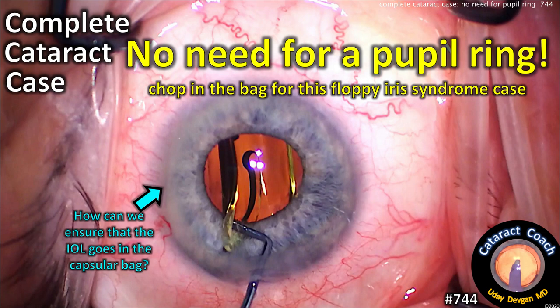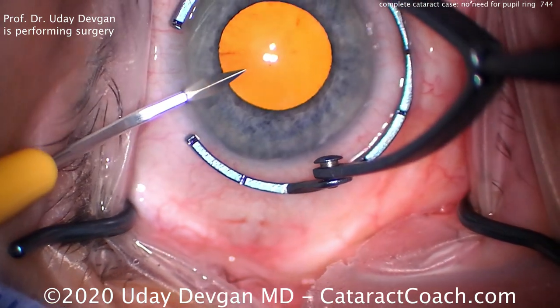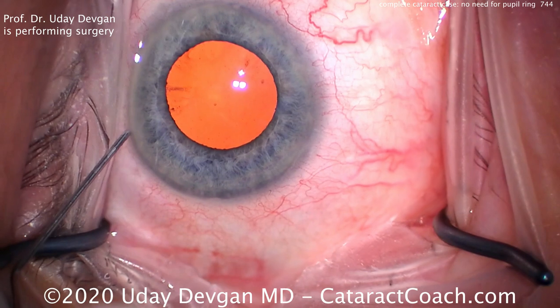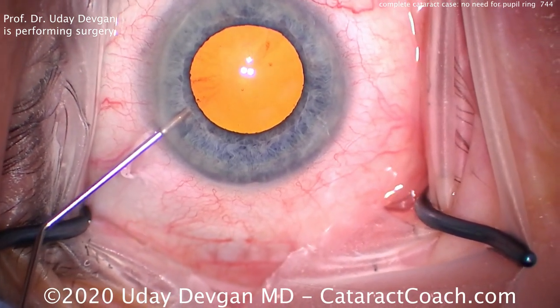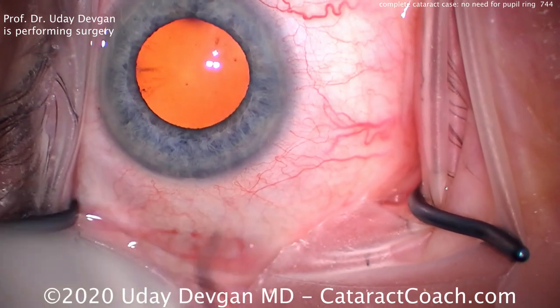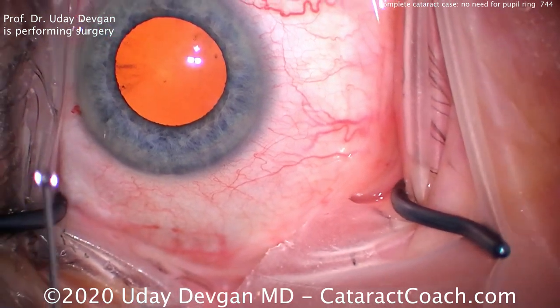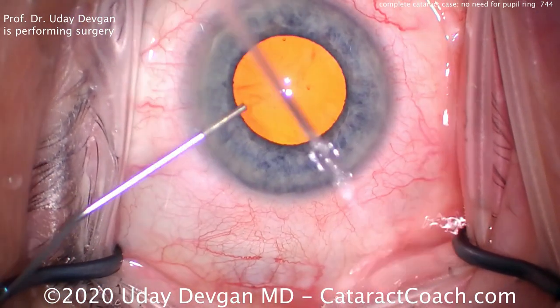CataractCoach.com, complete cataract case. There's no need for a pupil ring. Let's show you how to chop the nucleus in the bag in a patient with floppy iris syndrome. Starting off at the beginning of the case, there's the paracentesis. You can see that dilation looks pretty reasonable. This patient got a lot of phenylephrine and tropicamide in the pre-op area before surgery and got reasonable dilation. But we know the patient has long-term use of Tamsulosin or Flomax and we're expecting floppy iris syndrome.